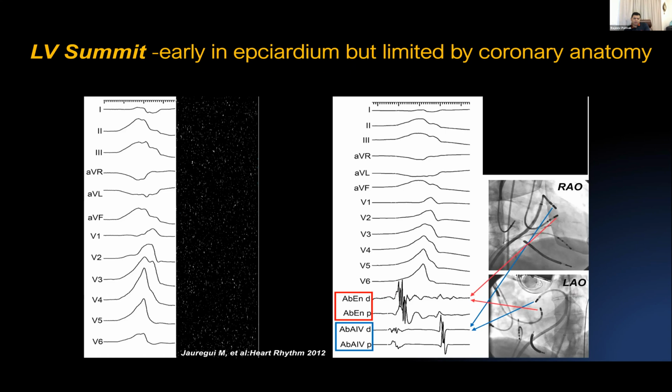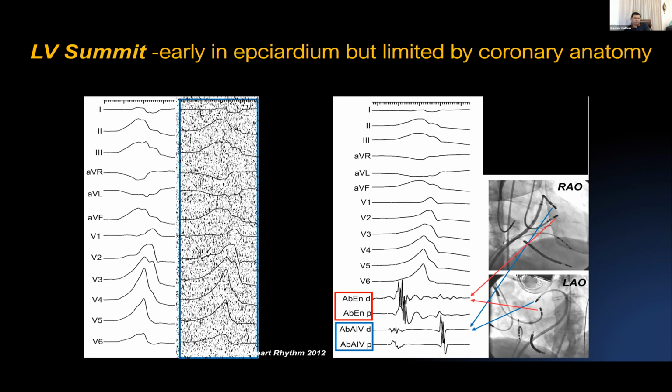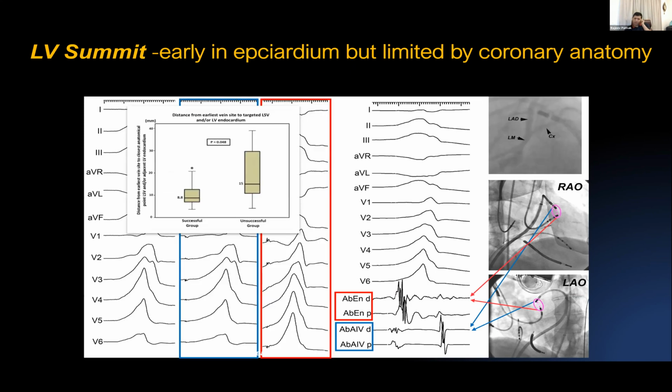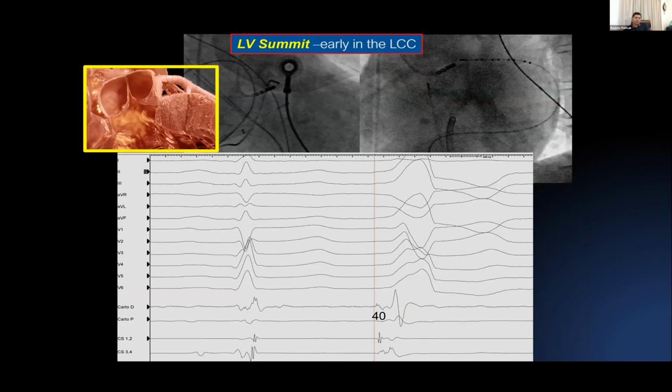We have done that already. We've discussed this, and we normally often do the pace map in this region. We have discussed this part already. Now, when we are doing this ablation, it's extremely important, as we discussed from the anatomical relationship perspective, that we map in the adjacent areas.